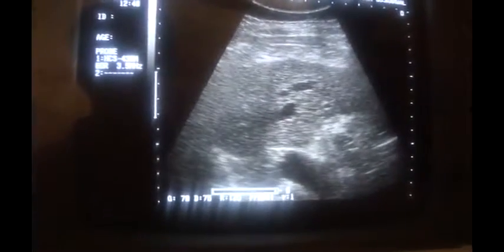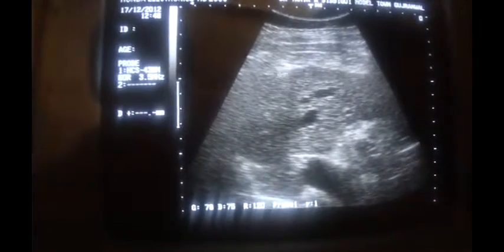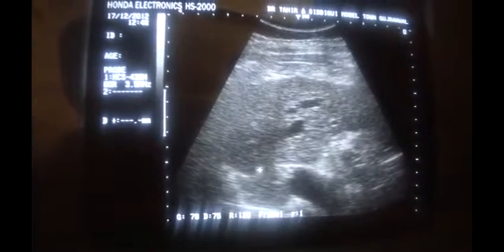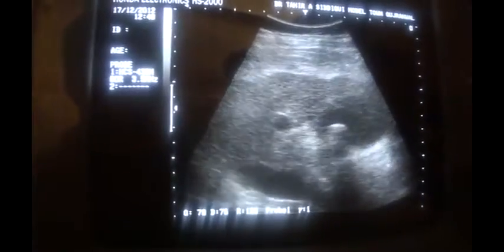This is that of the liver parenchyma, in which you are seeing that the outer surface of the liver is irregular. There is coarseness and the vessel margins are blurred. This is the right lobe of the liver, and see the GB wall.